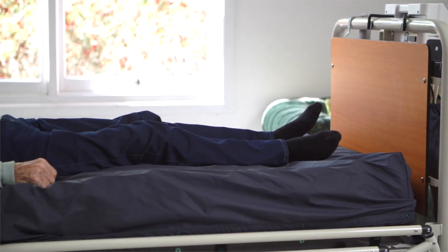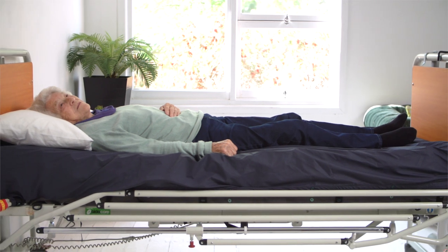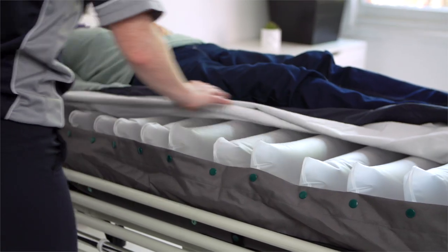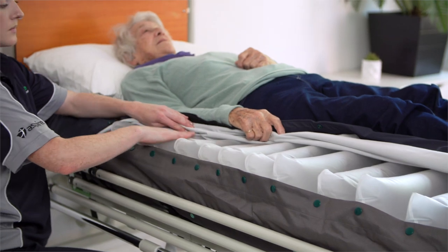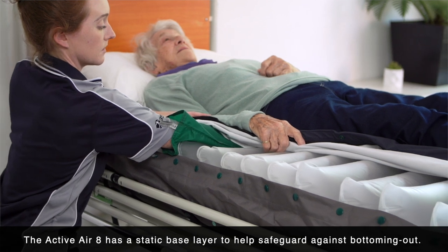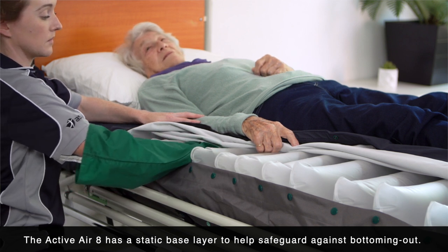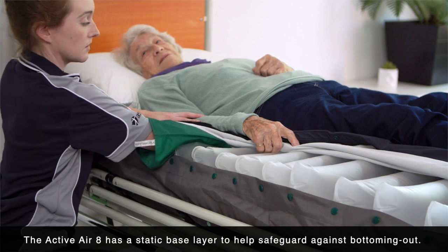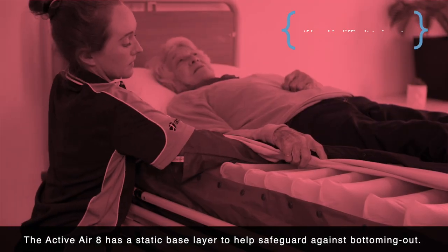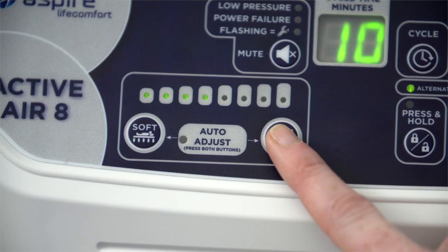Even with the recommended settings, it's good practice to carry out a bottoming out test to ensure optimal setup for the user. With the user lying on their back, unzip the cover at the buttock area to expose the mattress cells. Find a cell that is deflated and slide your hand underneath the user, pushing down on the deflated cell — a low friction glove can help with this. Your hand should easily slide between the user and the mattress surface, allowing approximately 5 cm of clearance or wrist height. If your hand drags or is difficult to insert, increase mattress pressure to prevent bottoming out. Do this and wait 10 minutes before retesting.